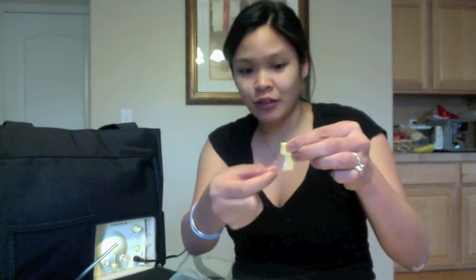And then there's this white membrane, and this is what causes the suction. Even though it looks a little bit flimsy, this is one of the most important pieces to your pump. If for some reason, while you start pumping, you feel like you're not getting enough suction, it might be because this thing is not on correctly. It needs to be flush to the valve, and when you pump, it constantly opens and closes. So this is a very important part.